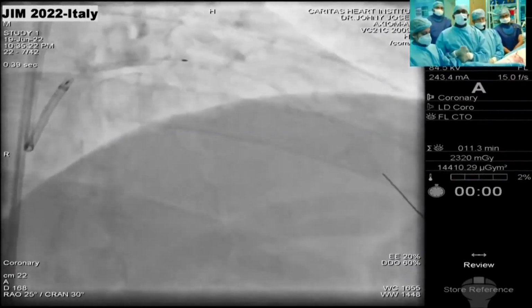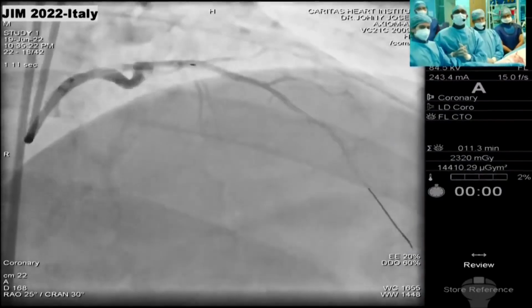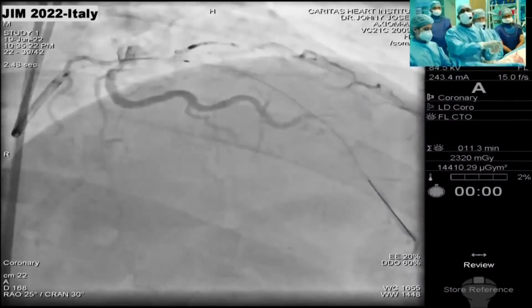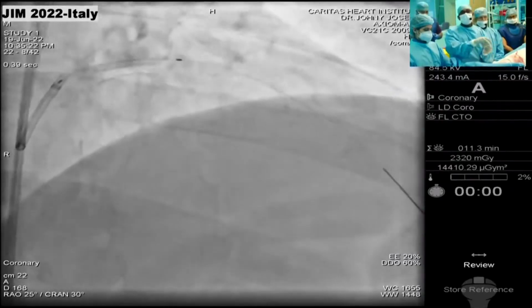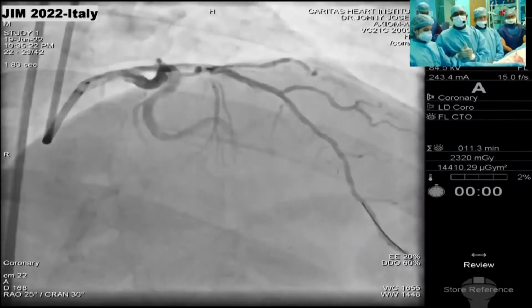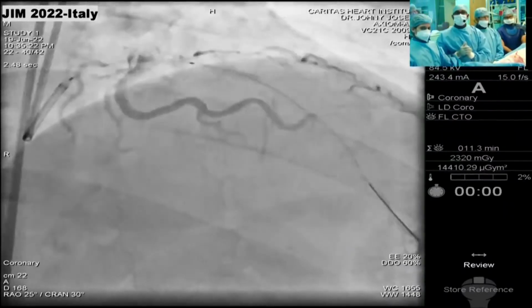Now our plan was to go ahead with stenting of the left main into LAD overlapping with the first stent. We didn't want to have wires inside the diagonal branch because based on OCT, the angles were all looking good and there was no significant disease at the mouth of the vessel. So we didn't really have a wire inside the diagonal branch. While putting a stent across the left main into the LAD, we would invariably have a wire there. So that's what we are at right now. Next image.